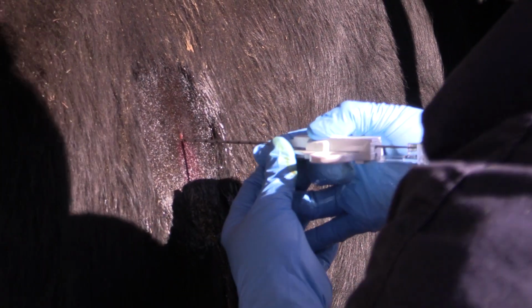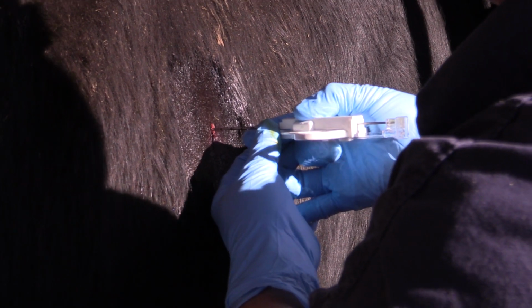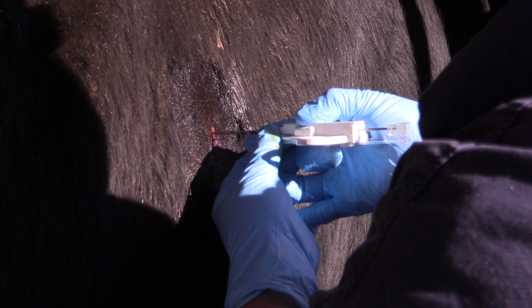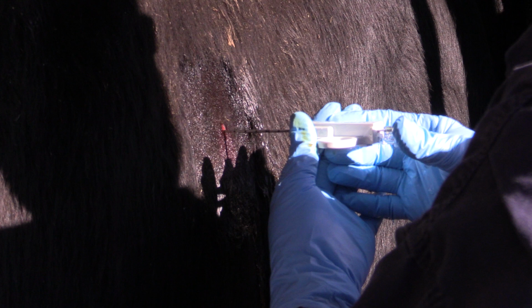Gently advance the biopsy needle another 1 to 2 centimeters until a pop is felt and stop. This indicates you have penetrated the liver capsule. The total distance of penetration is 1 to 2 inches in most adult cows and 1/2 inch to 1.5 inches in calves. Once the capsule is penetrated, slide the inner stylet forward to open the notch by pushing the spring-loaded handle forward until there is slight resistance.